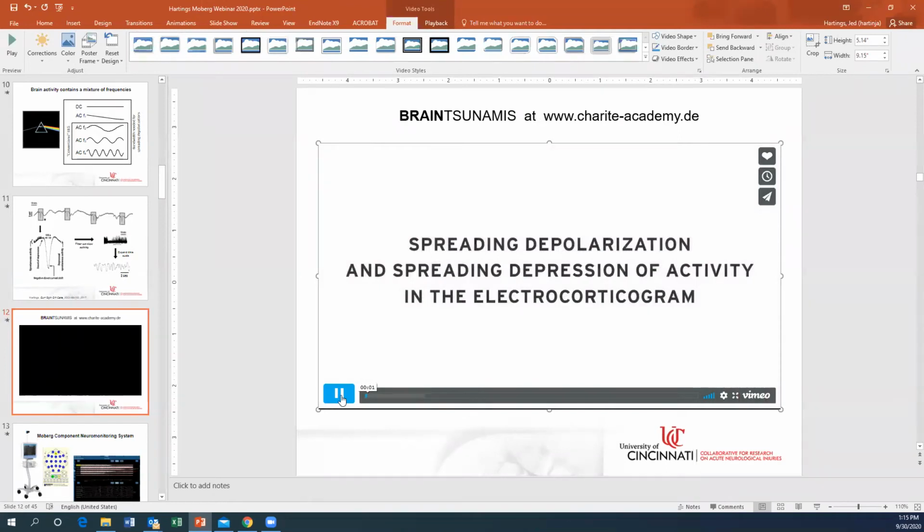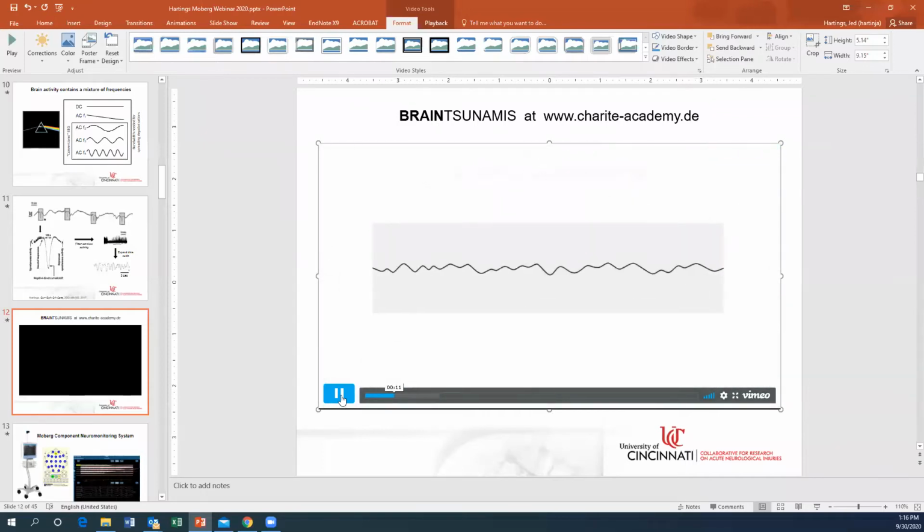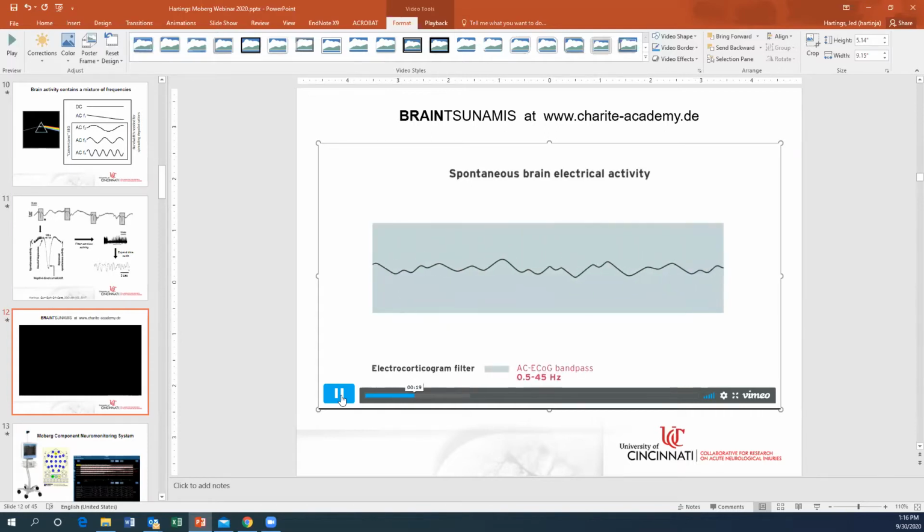In this video, we'll look at the difference between spreading depolarization and spreading depression in the electrocorticogram. If we want to examine the individual waveforms of spontaneous brain activity, that is, the fast-changing components of the electrocorticogram, we normally filter out the very low frequencies, and we look at an expanded timescale. Here, we're only looking at 5 seconds per frame. The amplitude of spontaneous brain activity typically lies in the range of a few hundred microvolts or less. If we zoom out of this view to a 40-minute frame, the individual waveforms of the spontaneous activity become less and less visible.